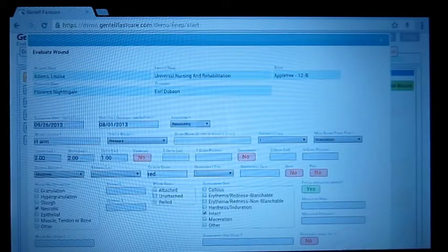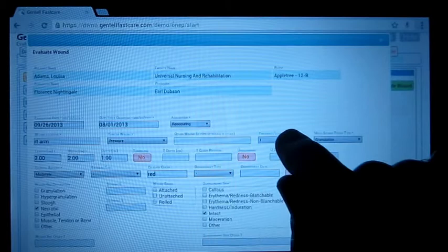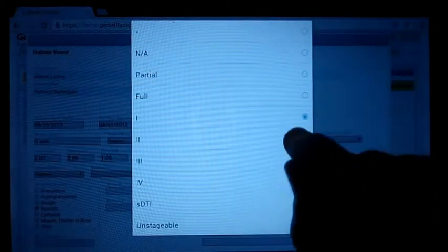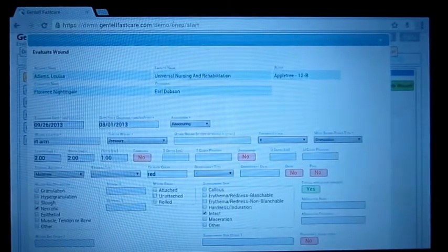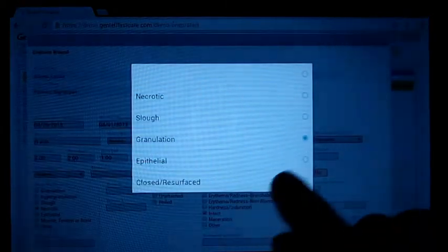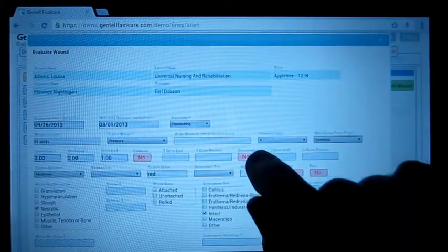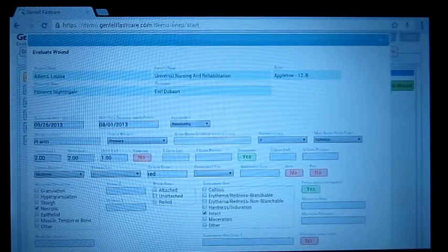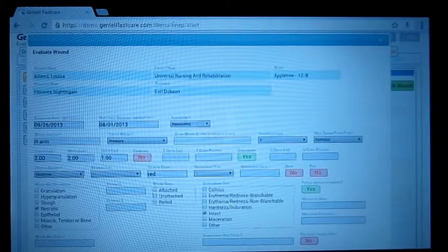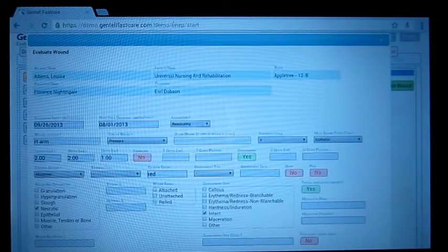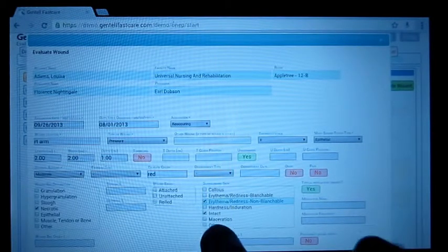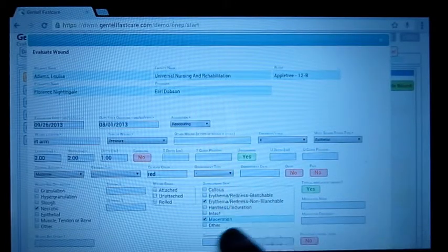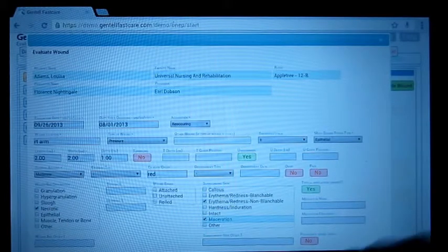Here's how easy it is to enter data. If I wanted to change the thickness or stage, up pops everything. If I wanted to go to the most severe tissue type, there are my options. Pink is no, green is yes, so it's easy to distinguish them quickly. You can pick from options in the list. This is surrounding skin, the wound bed description.